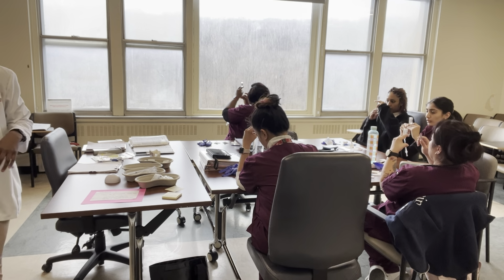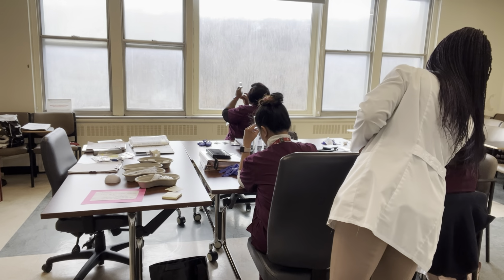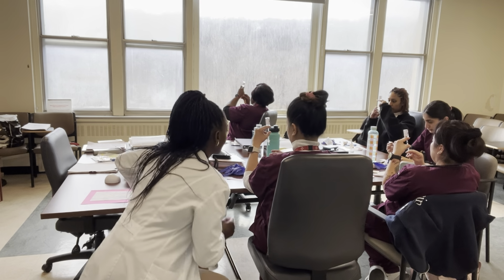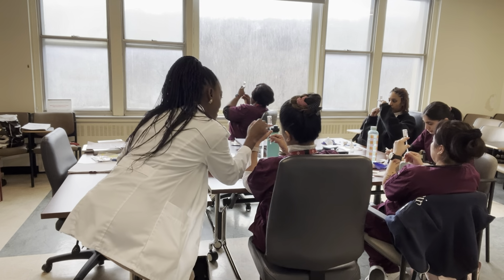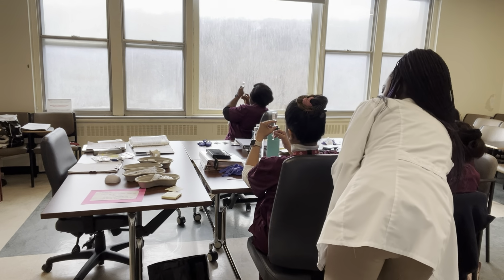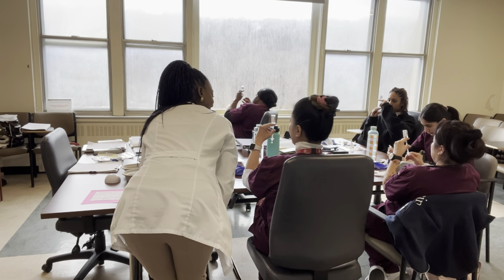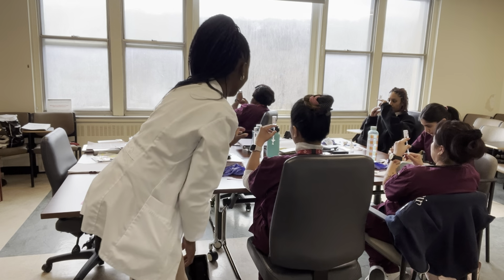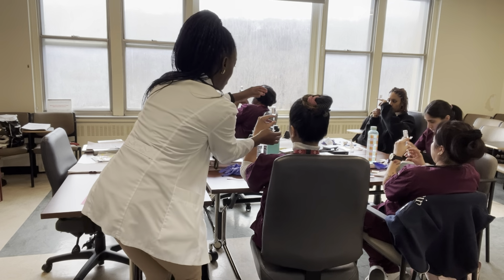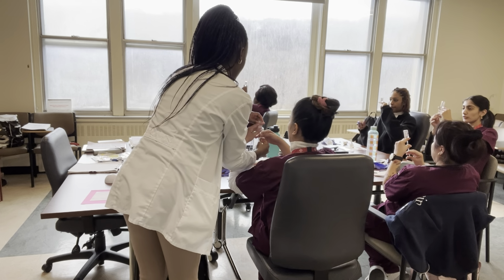Charlene, your fingers around the neck of the vial. There we go. Is that better? And if you have air bubbles, just push all the air back. Okay, let's see. So I'm looking at the vial. Okay, it's the right insulin. I don't see the date that it was opened. How come you didn't mark the date that it was opened? I think it was brand new. There was a cap here. Okay, so it expires in 2027. And then you have, sorry, it's hard to see when it's low, 5, 6, 7, perfect, 8. Yeah, you did the right thing.